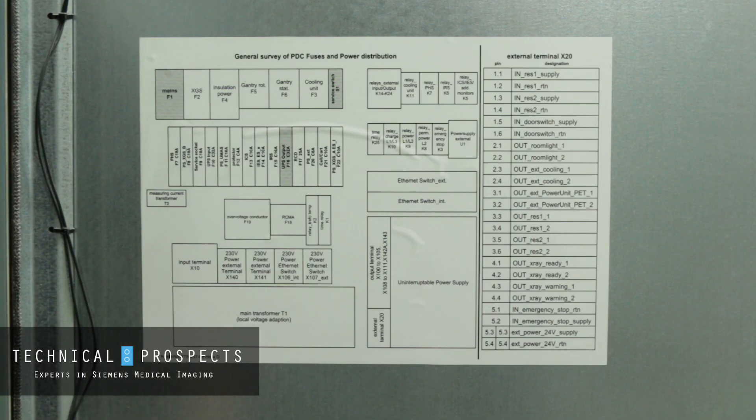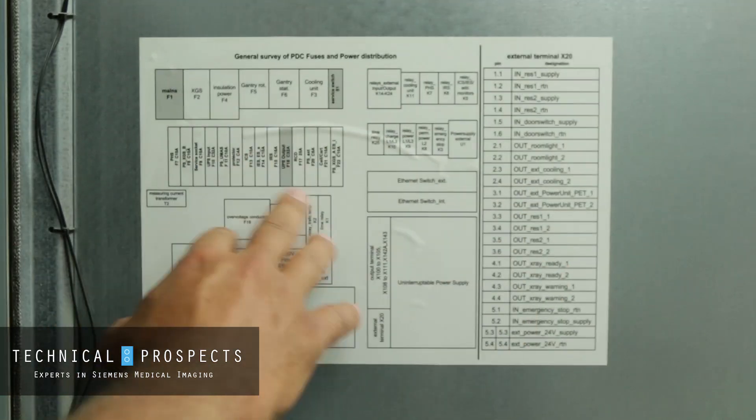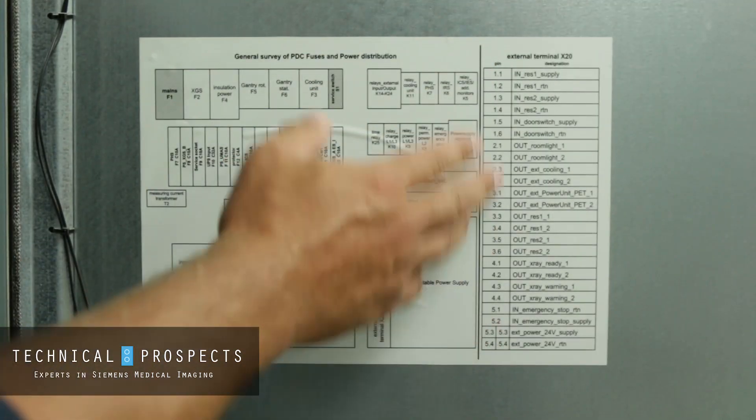Now that you have your system with the computer system only running and the gantry in the process of being shut down, to safely service it, it's time to figure out what breakers you need to have off. One good tip to know is inside the PDC — the power distribution cabinet door — there's a chart that shows what each breaker does, where they're located in the room, and the explanation of the signal names.